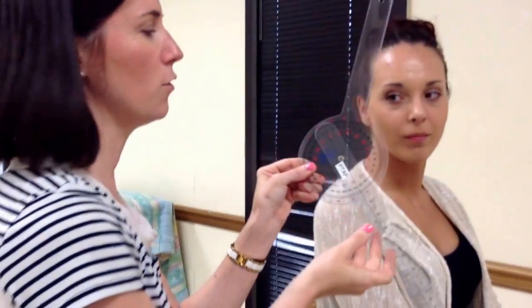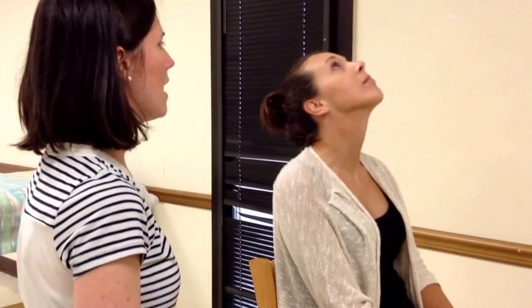Then we're going to do cervical extension. The normal value for cervical extension is 0 to 60 degrees. The instructions to the patient are going to be: can you bring your eyes and head up to the ceiling as far as you can?